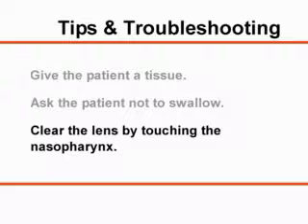If the endoscope becomes covered with secretions, it can be withdrawn and gently touched on the mucosa of the nasopharynx, which has diminished sensation. This maneuver will clear the lens and usually causes no discomfort.